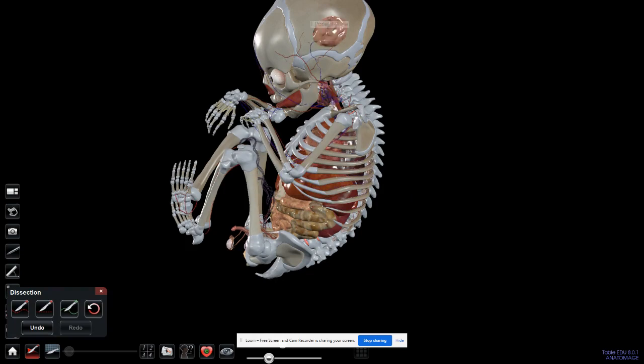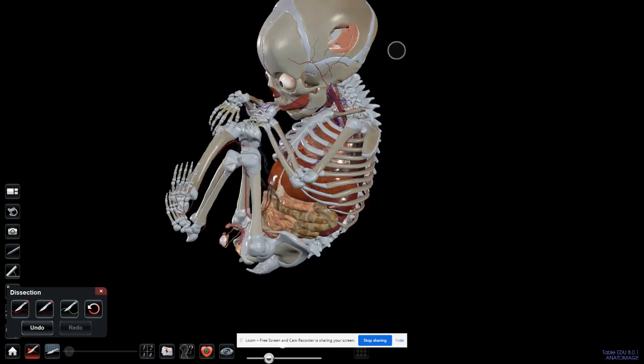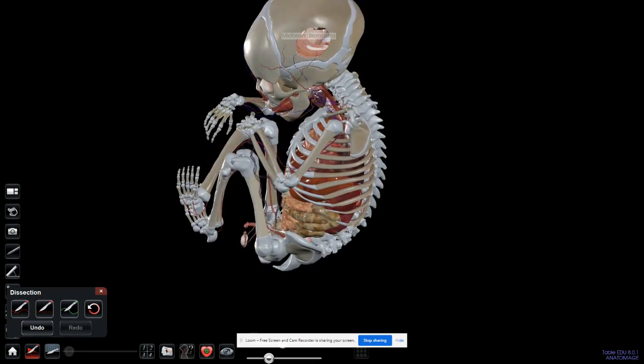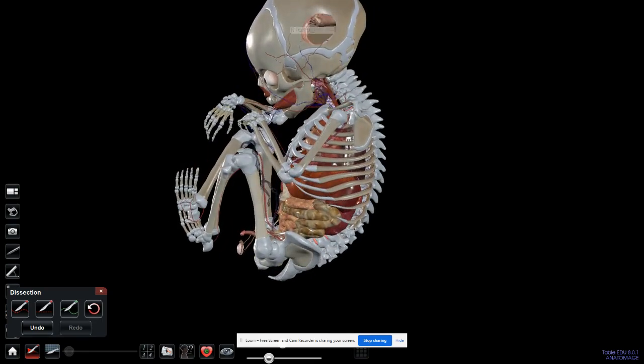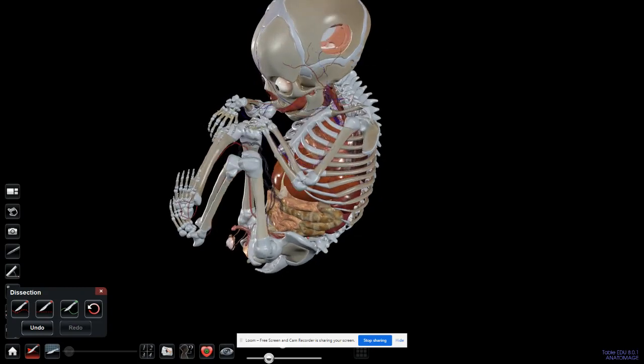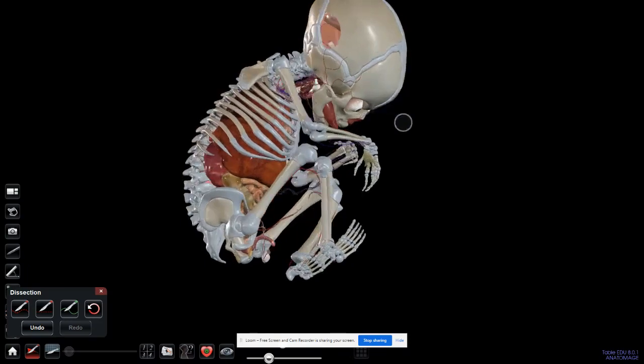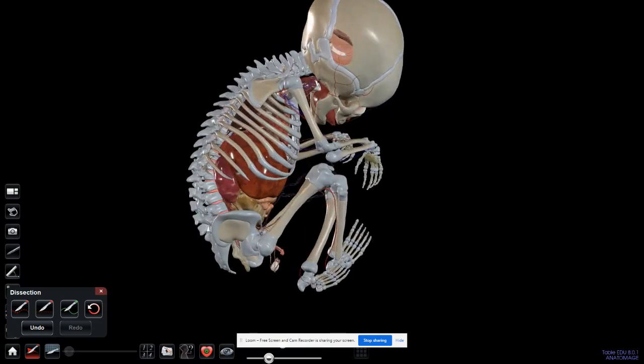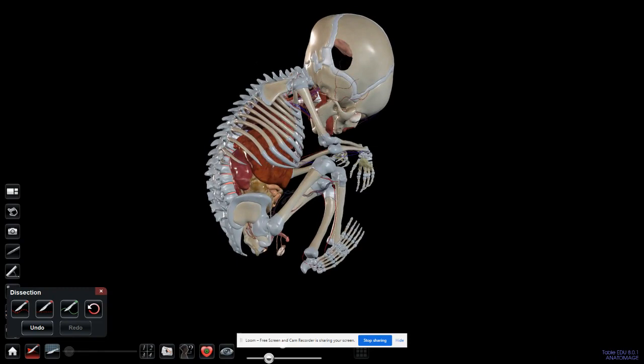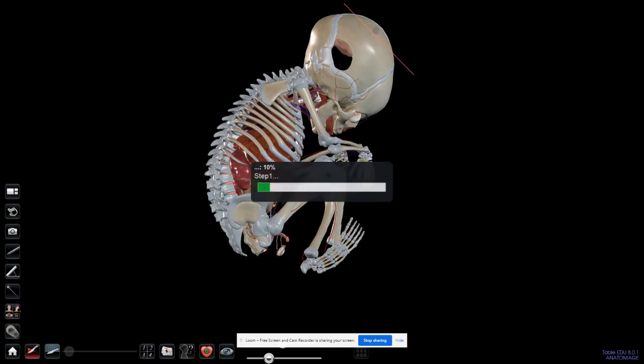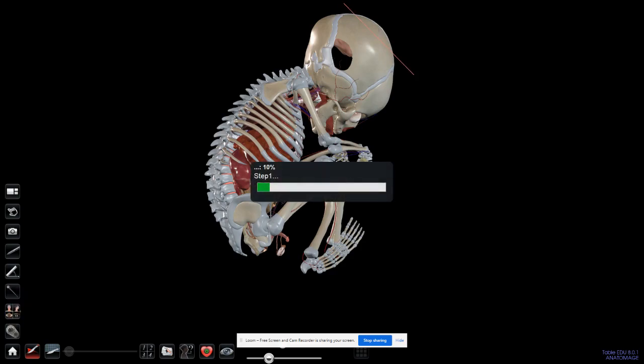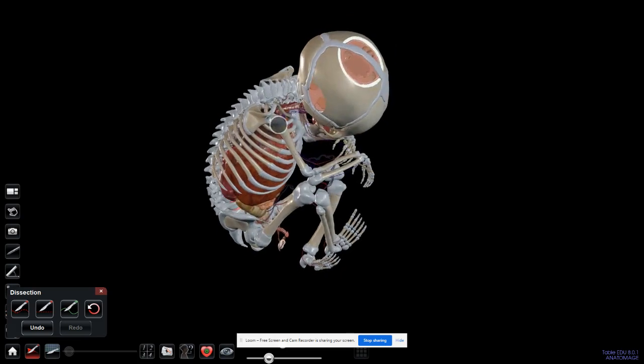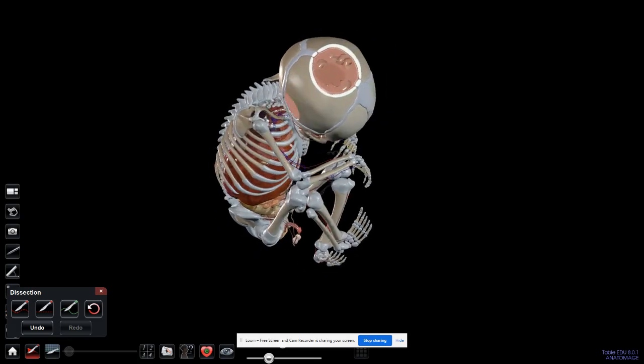As you can see, I still have this one—you can see through it now. I have dissected this portion of the skull. If I want to dissect straight and I want to remove the small portion from here, I click on the small portion and start also removing layer by layer. The only difference is the other one I could draw the way I want. This way, no, it's just straight.